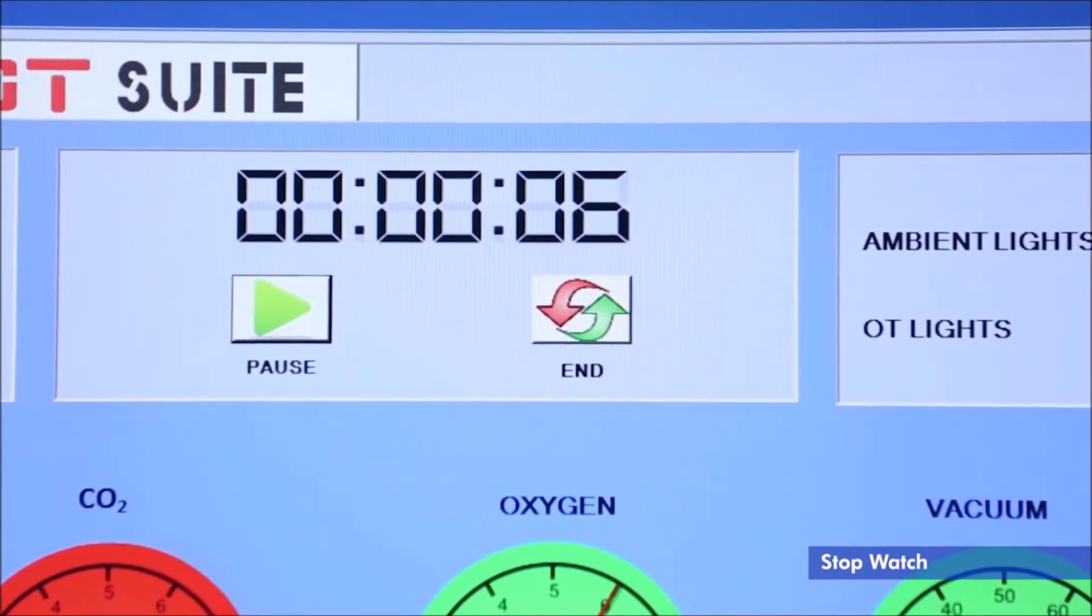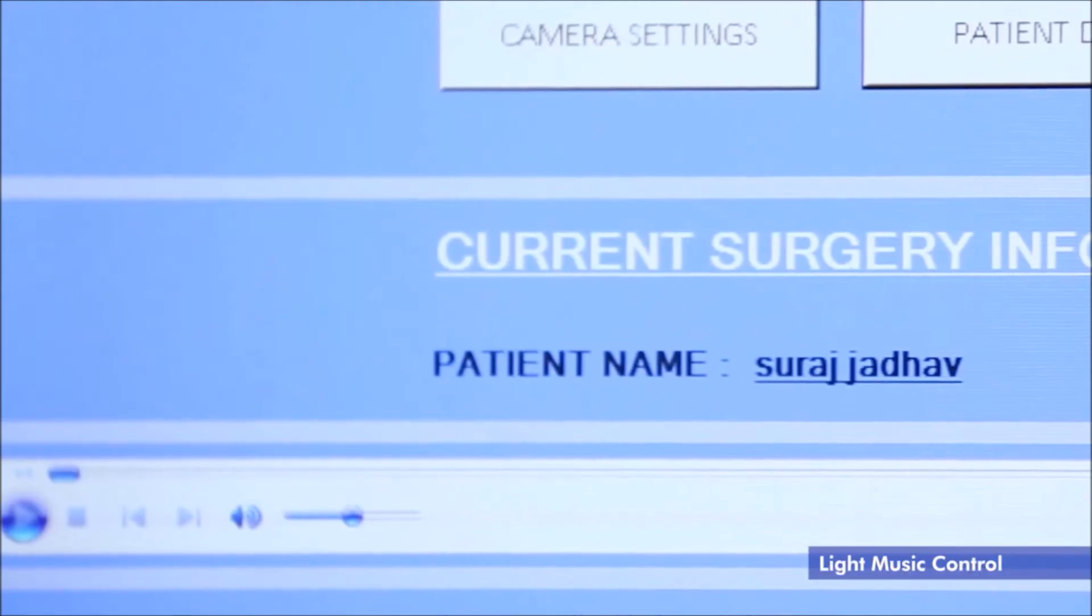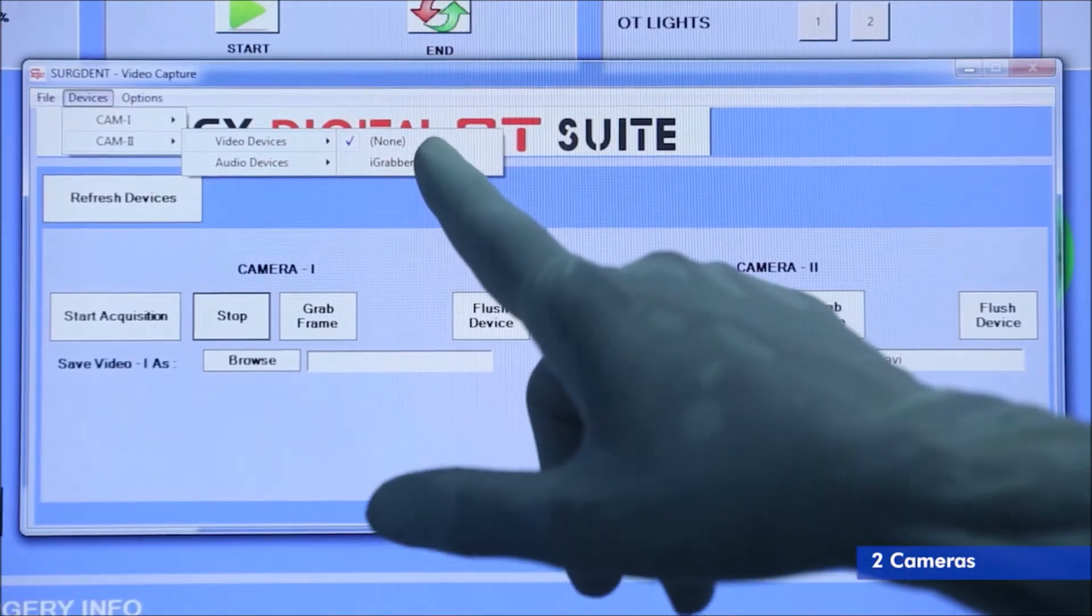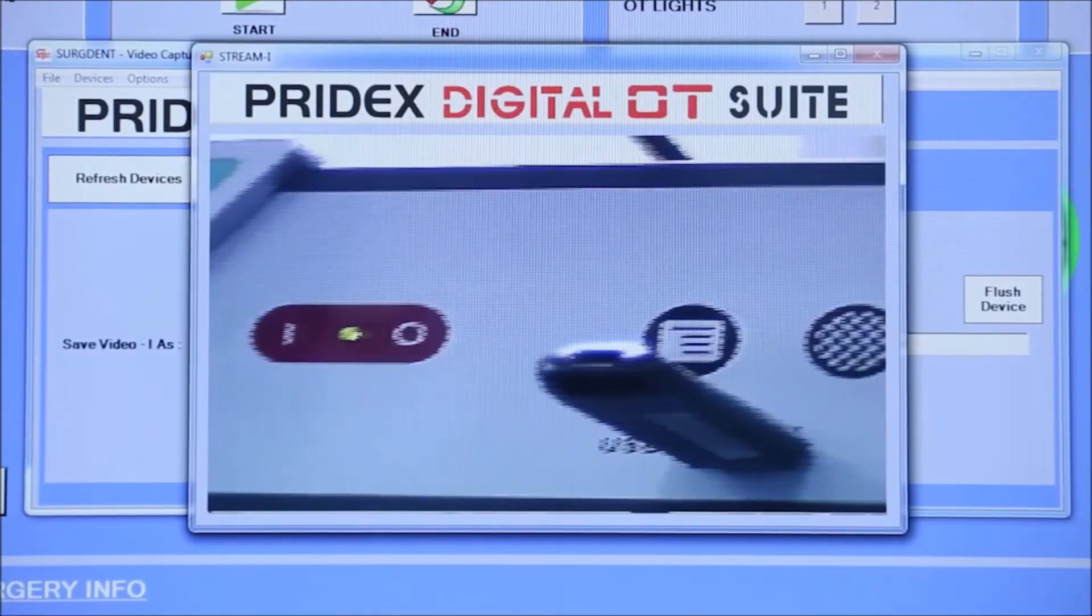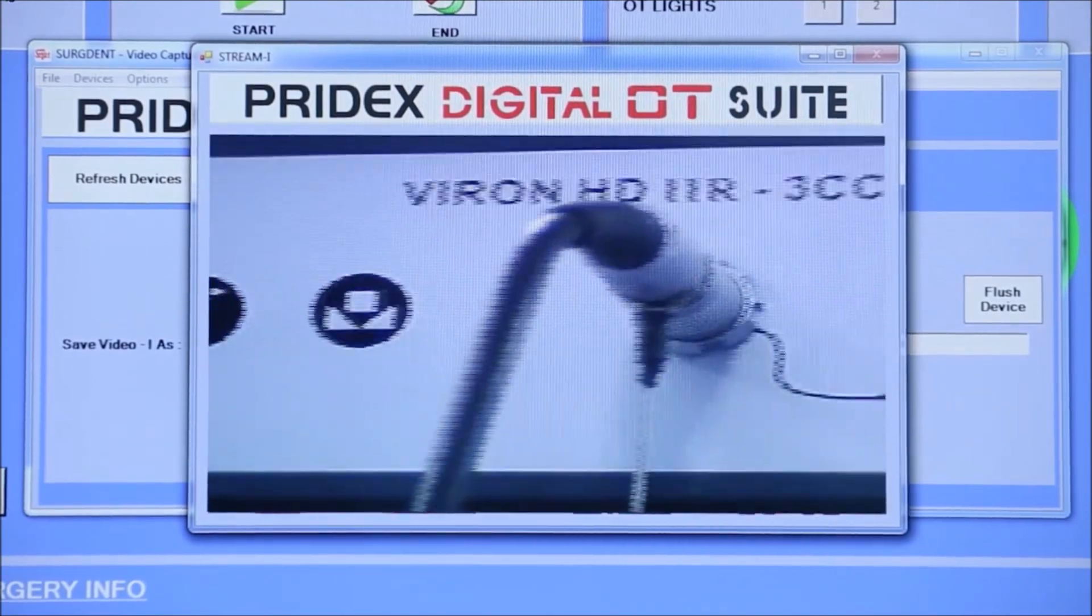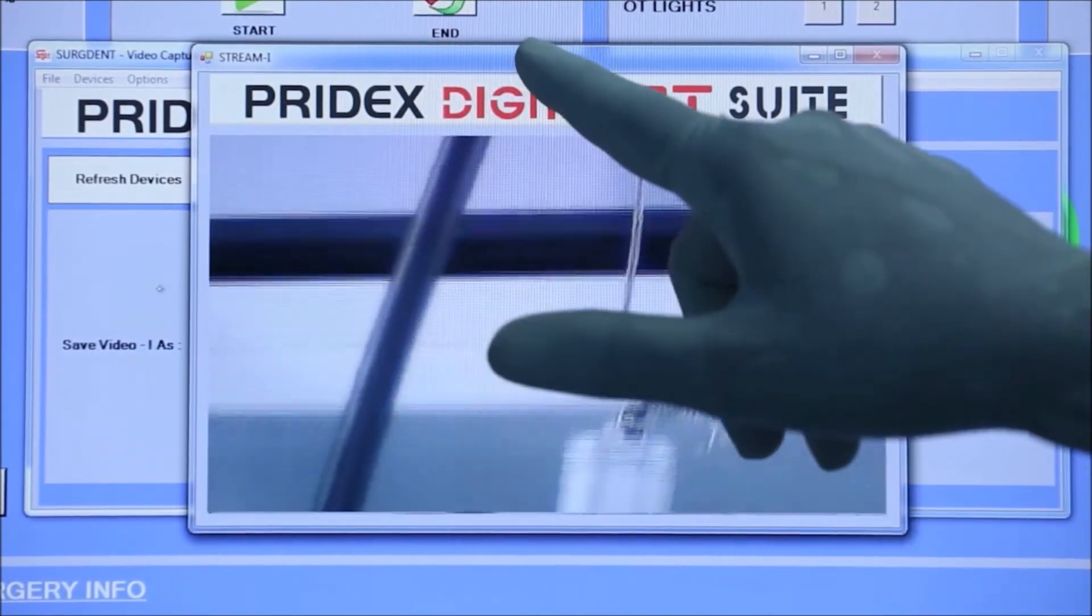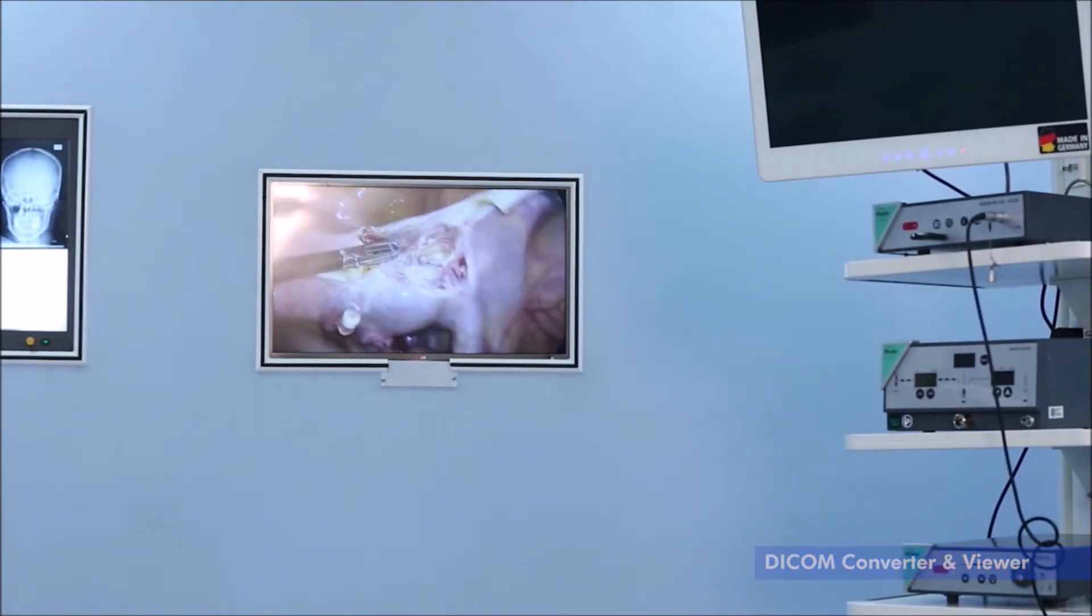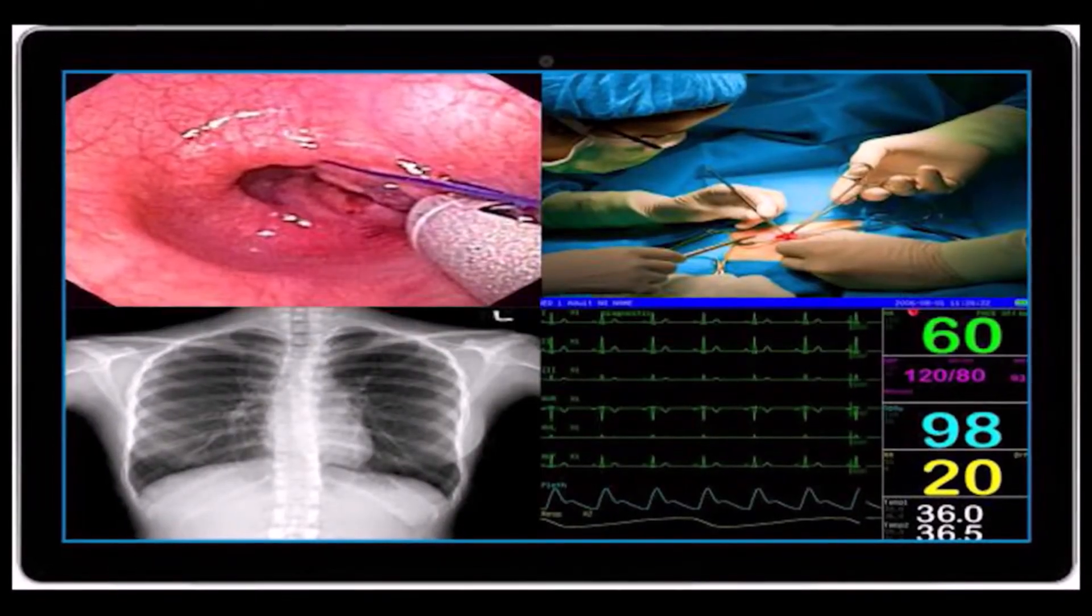Surgery recording system and wall monitors. Two cameras are provided for simultaneous recording. Recording can be done in full HD, integrated with hospital LAN network, DICOM converter and viewer. Wall monitors to show live surgery, split screen images, and radiology images.